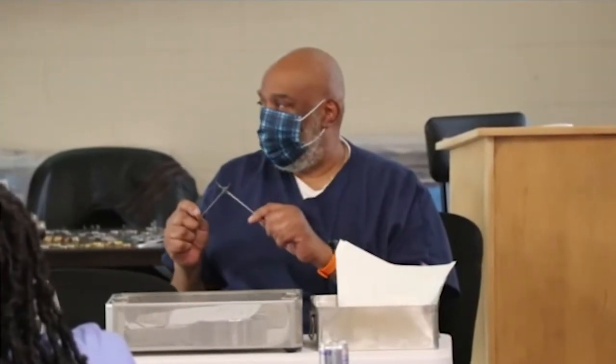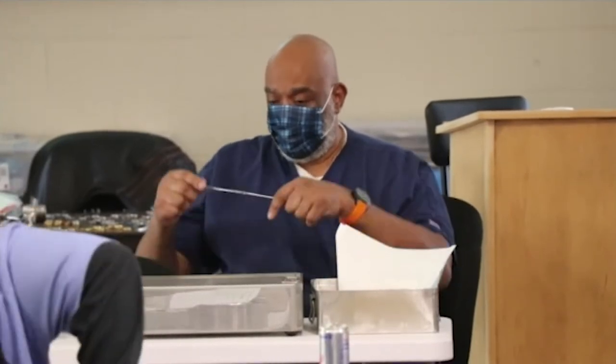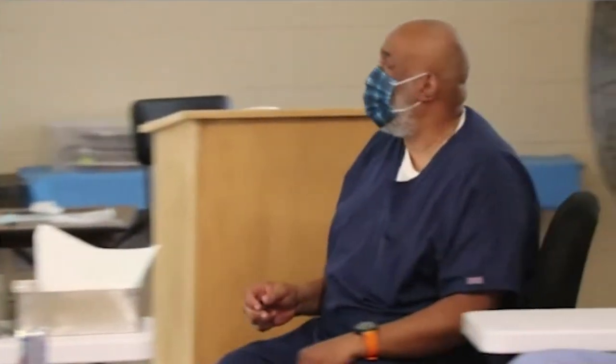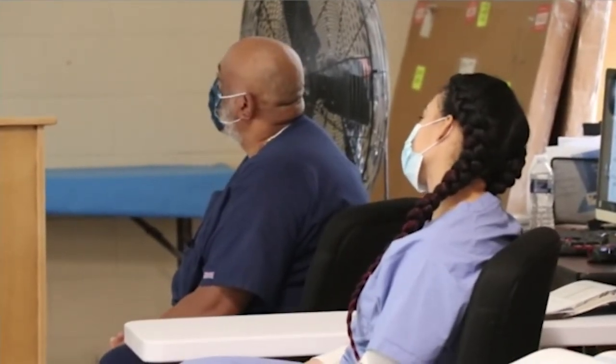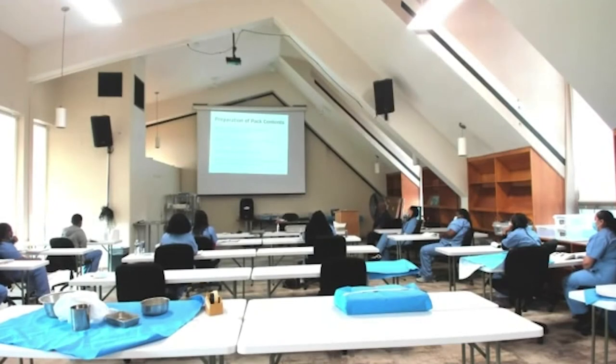With every instrument that you handle, you're going to be the last one to sign off on this tray before it gets to the OR. So you are making sure that it's correct, it's the right one, and as your count sheet says, you have the right amount. Good stuff. Questions for me so far? We moving pretty good? What does it say on the bottom line, Terrell? Assembly of a set that is neat, complete, and will facilitate the sterilization process. Excellent. What does it say before that? Protect instruments from damage. And we do that with tip protectors. Now remember this too.